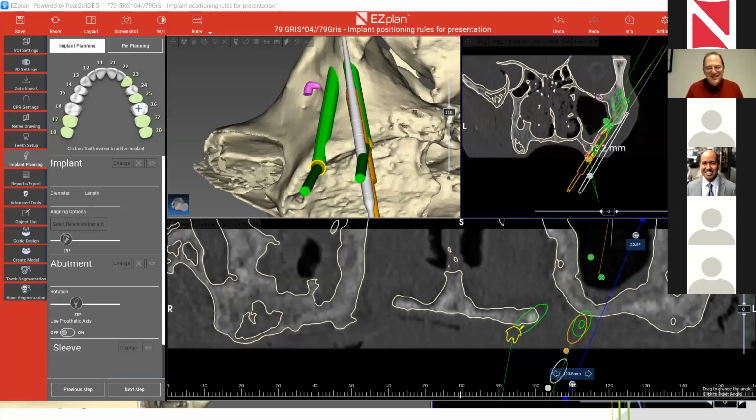I'm doing good. As you know, I've done lots and lots of these, and I love the drill system. But maybe a few weeks ago, I was doing just a standard double zygoma, and the bone was very dense, and I got the drill stuck in the zygomatic process. By the time I finally got it to penetrate, it just got stuck in there. I was just wondering if there's any tricks or drilling speeds that you suggest. I'm usually drilling at about 1,000 RPM. Well, even 800 is probably about average for me.